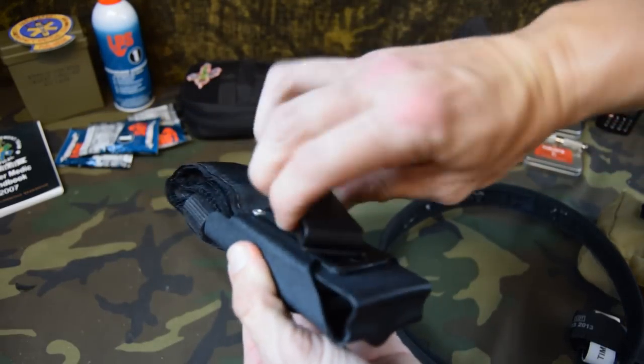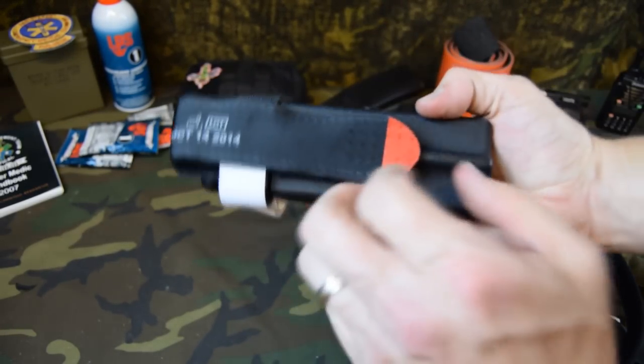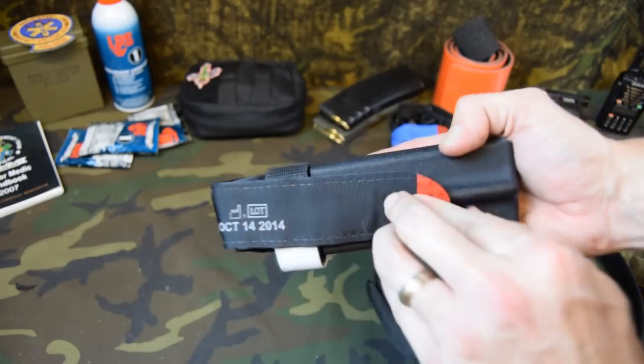It's got a belt clip on the back, rotates around, locks into position. Same theory — pull your red tab, get your tourniquet out.